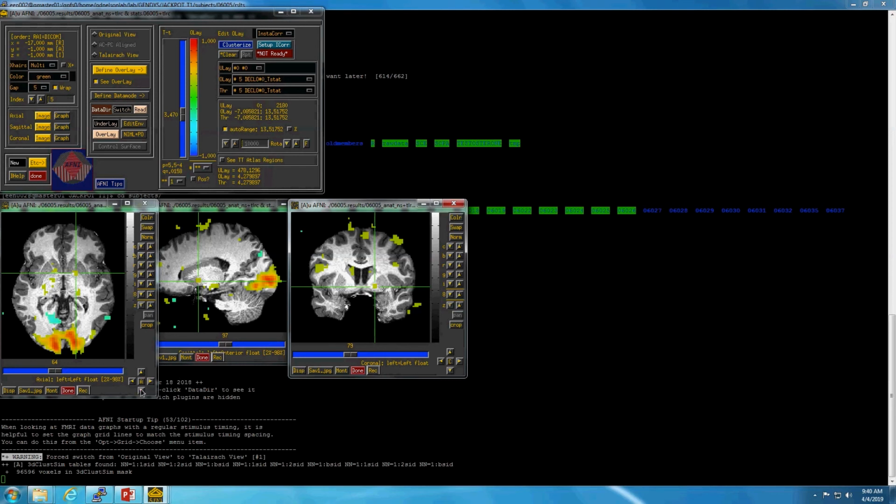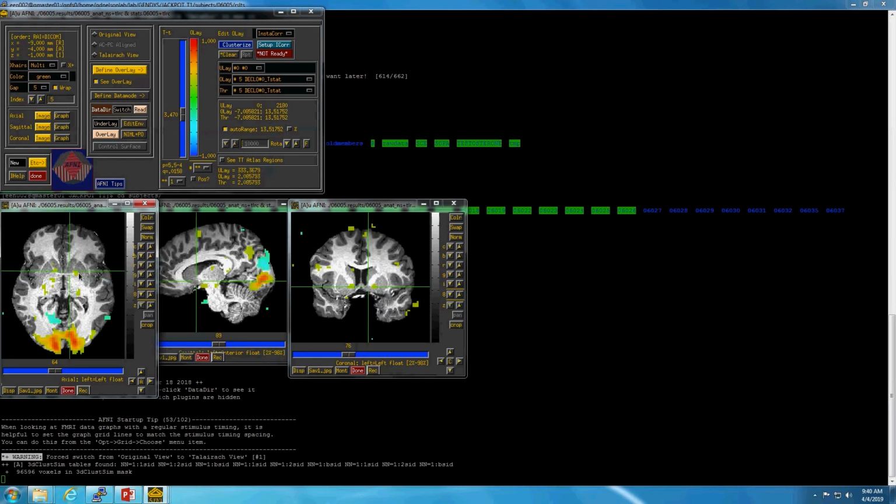So what we have been seeing is this really strong activation, this is not a great example, but in the ventral striatum in these different conditions. So when they're making their decision, when they win a reward, that's been pretty consistent, almost every subject is showing a pattern of activation in response to that condition, which is exactly what you expect. People have shown that lots of times. This is the reward area, it responds to winning something. It's also active when you are making a decision about whether or not you want to do something.